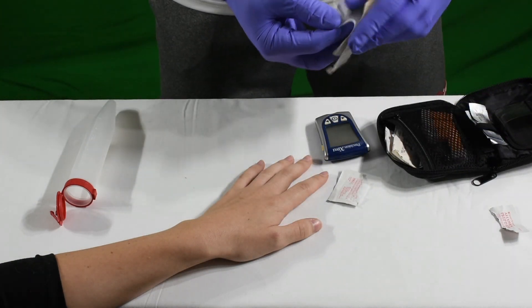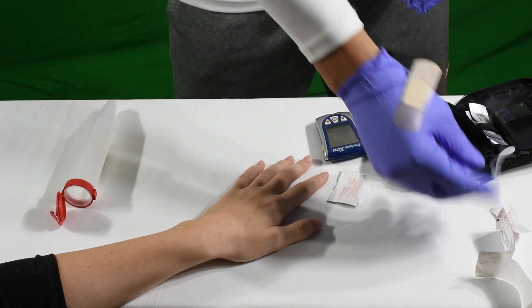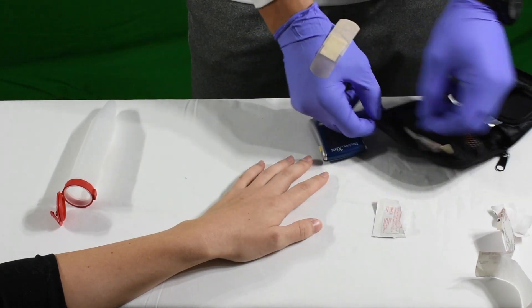I like to put one sticky side of the bandaid here on my glove so I'm ready to go with that. Get my lancet ready.